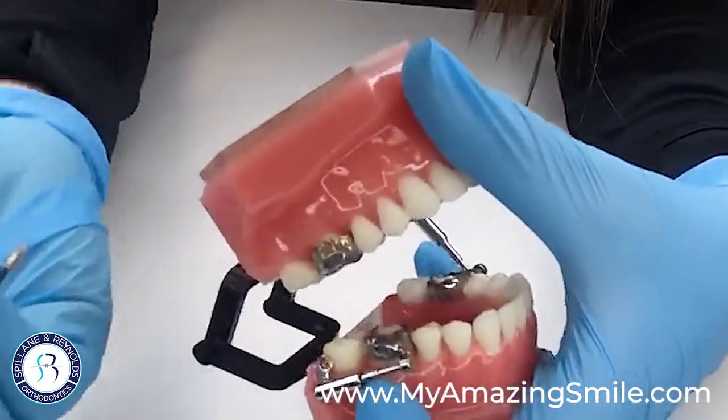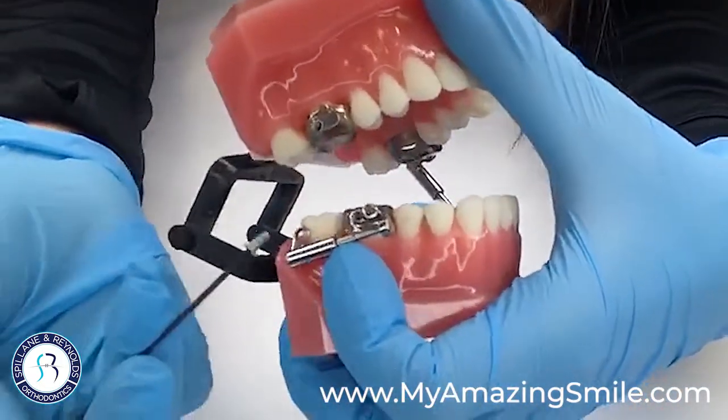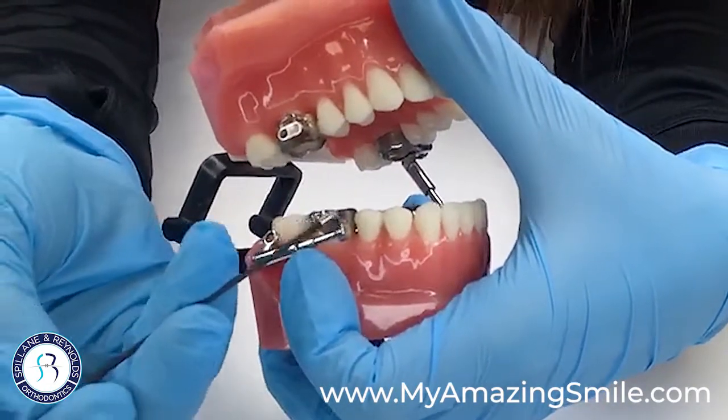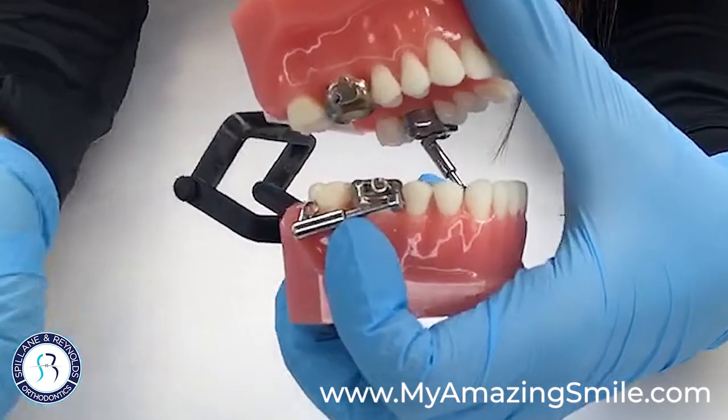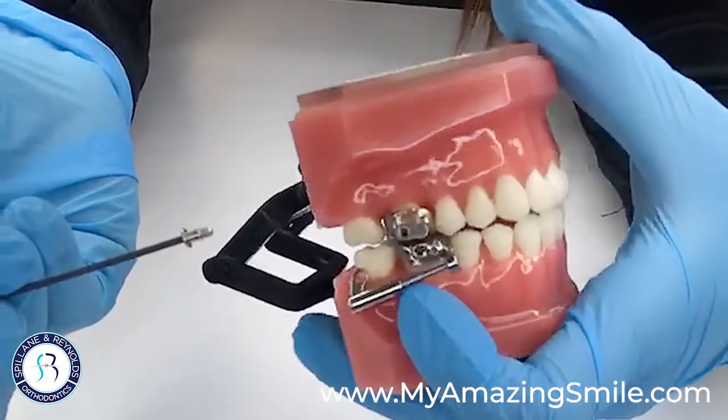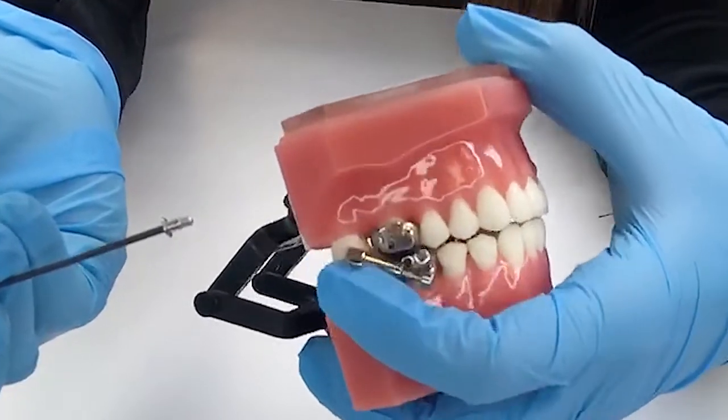Then you're able to have the whole piece come off. If this lower nut was out and that lower part of the arm was already disconnected, this will remove the whole thing. Just make sure you bring in the arm, the screw, and the screwdriver to your next appointment, and we will repair everything for you.